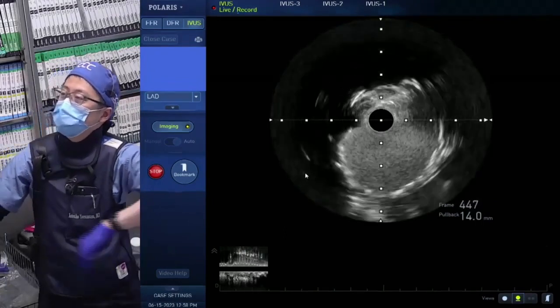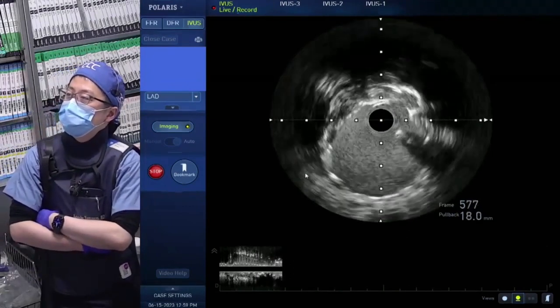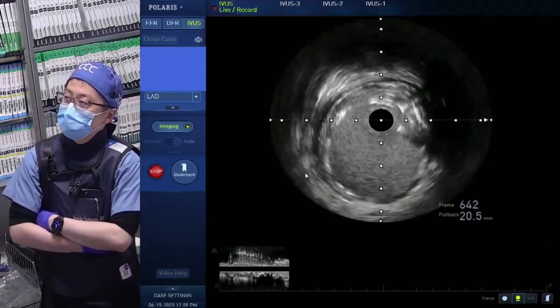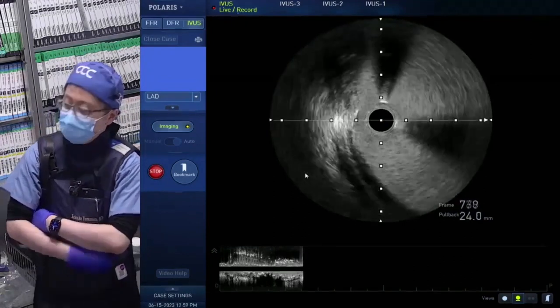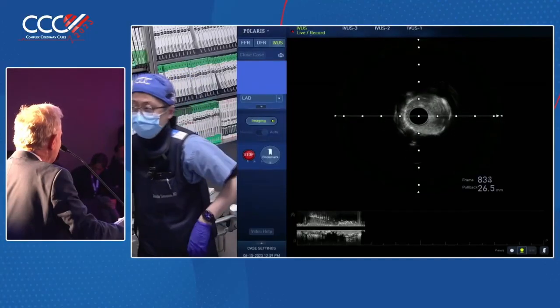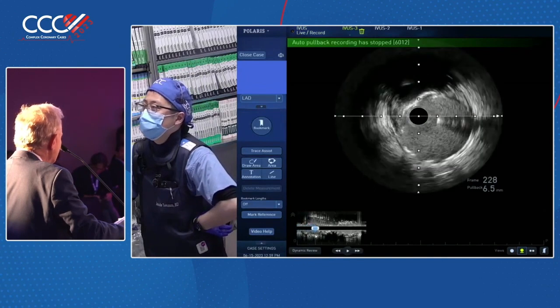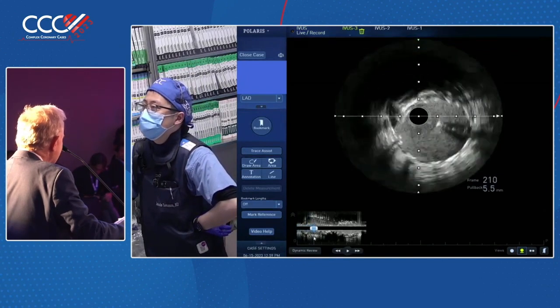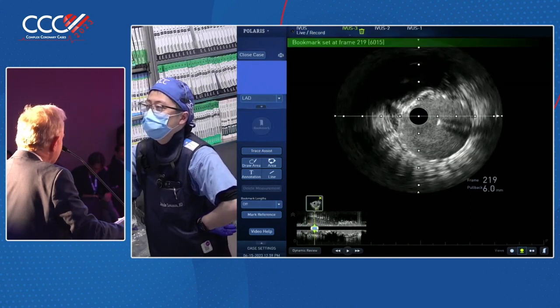Dr. Waxman has a comment. I heard a lot about DK crush, so I'll tell you why I don't like DK crush, so don't feel guilt. It's a lot of steps, but I don't care about the steps. You have no idea how many stent restenosis we're getting with DK crush. A lot of them. So maybe in China there is a magic, they know how to do it, but we get a lot of cases for brachytherapy, restenosis on both arms, not only circumflex, also LAD.